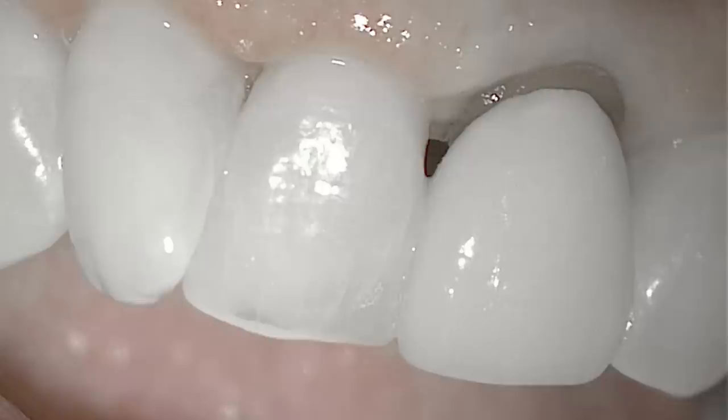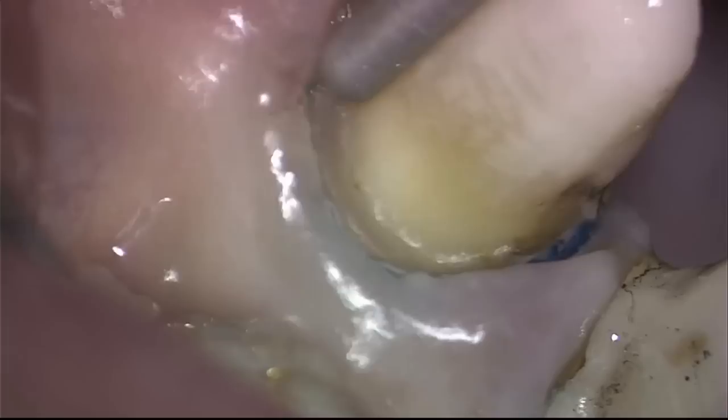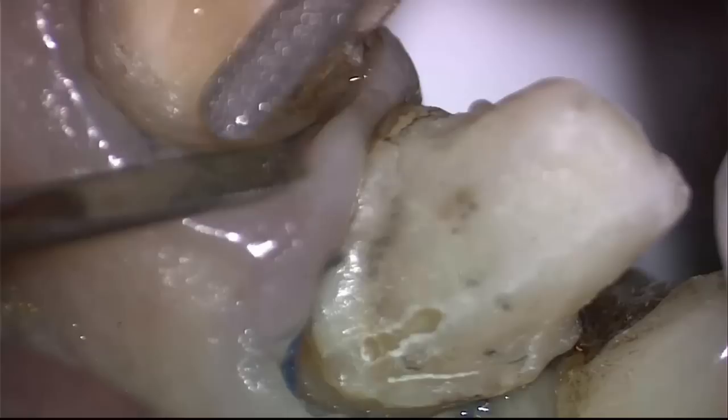There's another situation here where looking at a tooth with a very poorly fitting crown. This crown was supposed to fit up there, but the accuracy obviously wasn't done. So this is not the same tooth, but if you can prepare the margins of the preparation for a tooth at 9x or in this situation at 14x, you're going to get a much, much more accurate fit. It's going to feel better, it's going to fit better, and it's going to last longer.